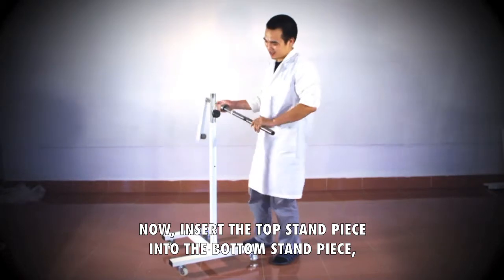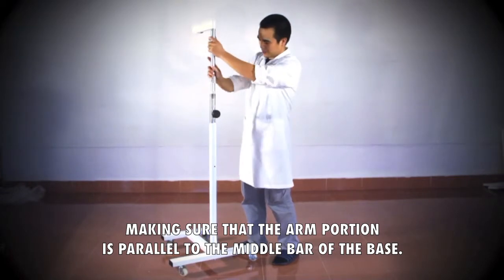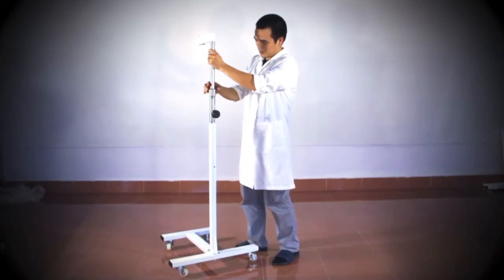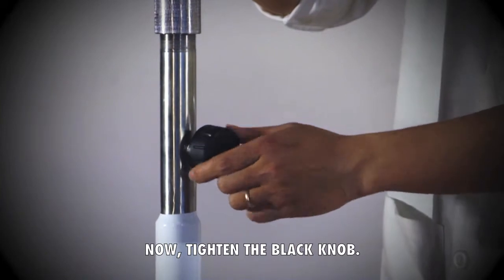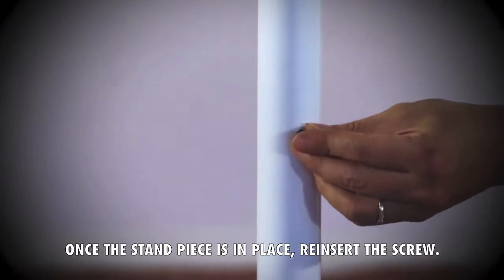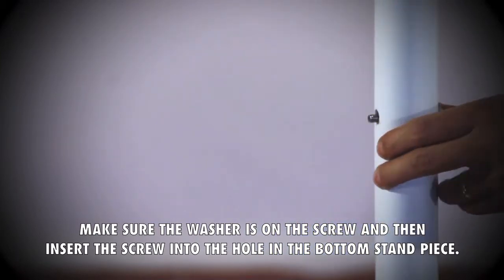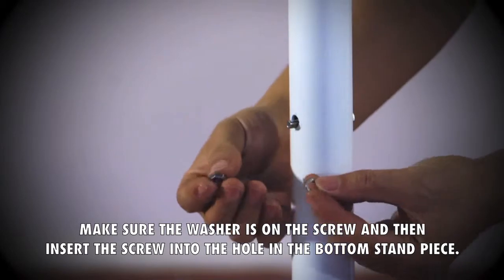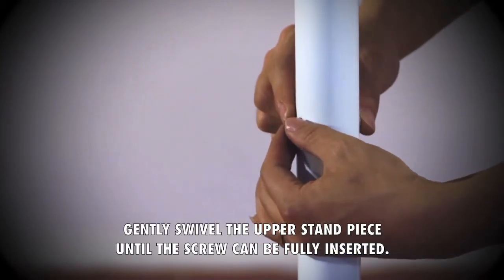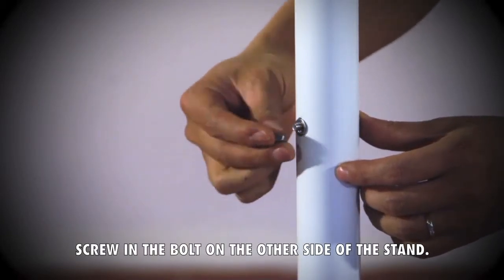Now insert the top stand piece into the bottom stand piece, making sure that the arm portion is parallel to the middle bar of the base. Next, tighten the height locking nut. Now tighten the black knob. Once the stand piece is in place, reinsert the screw. Make sure the washer is on the screw and then insert the screw into the hole in the bottom stand piece. If it does not go all the way in, gently swivel the upper stand piece until the screw can be fully inserted. Screw in the bolt on the other side of the stand.